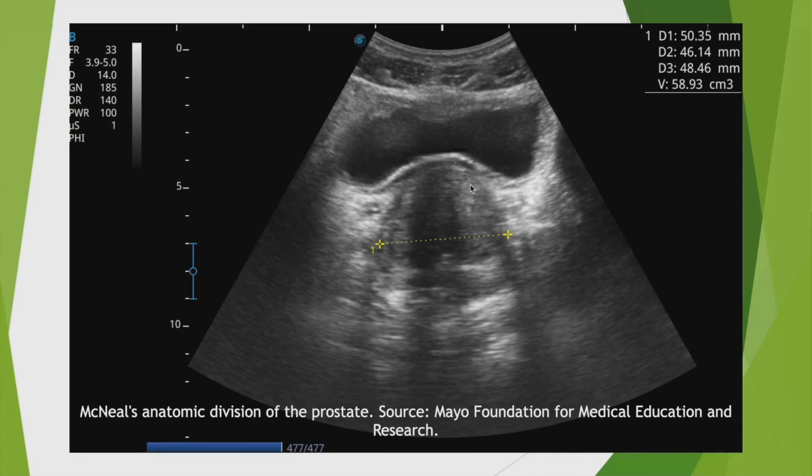So there you are, noticing your classic cut. Forward, our anterior zone. The two circles you can see here are in fact the transition zone, which is quite swollen in this patient whose prostate measures 60 grams. And back here, sometimes it's hard to tell whether it's part of the prostate or not. Is this a prostatic zone or not? Here, with a slightly different echogenicity, we see this peripheral zone, the most posterior of the prostate, in direct contact with our rectum. So you can see that in fact the prostate is this whole area here, which includes both parts, the transitional zone and the peripheral zone.